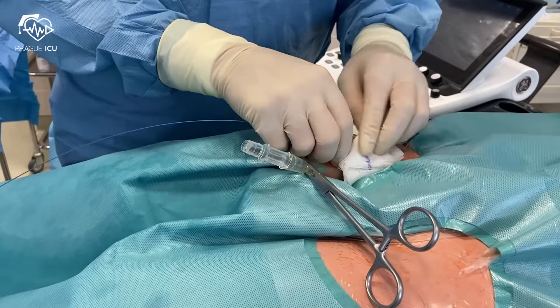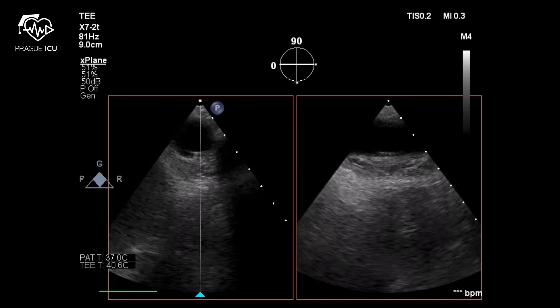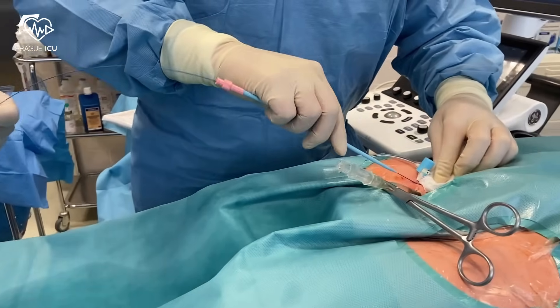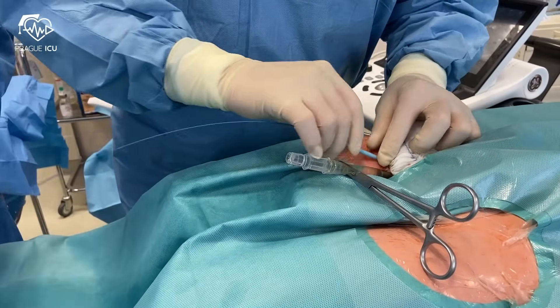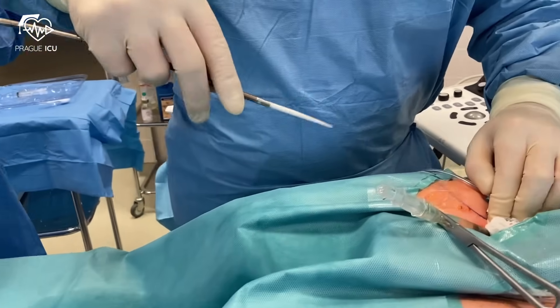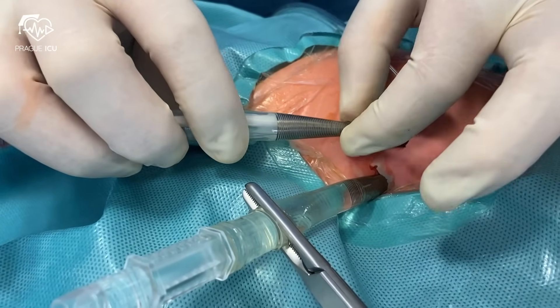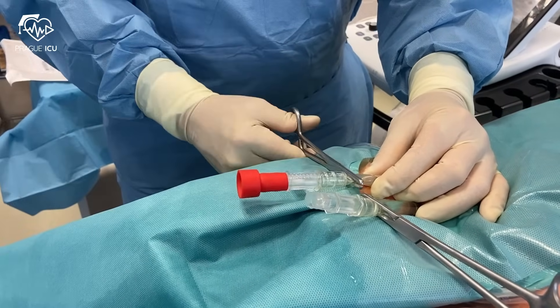Then continue with the insertion of the arterial ECMO cannula. Insert the stiff wire over the sheath and confirm the position of the wire in the descending aorta under X-ray or transesophageal echo. Make an extensive superficial incision as this will help with a comfortable insertion of the large-bore dilators and cannula. Then gradually dilate the tract. Finally, insert the arterial ECMO cannula, remove the wire with the introducer, and clamp the cannula.